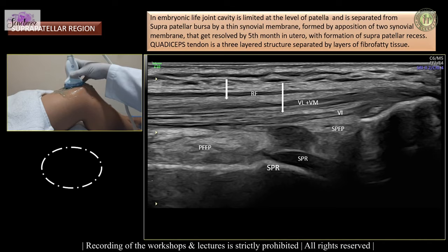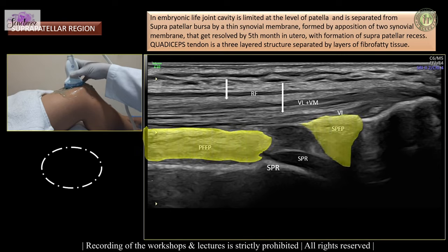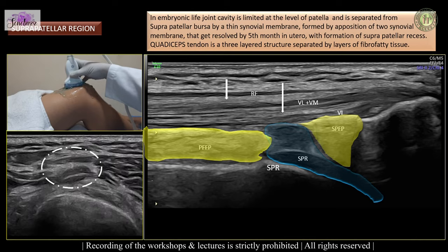Underlying this, we have the suprapatellar fat pad and prefemoral fat pad, which are well-defined and slightly compressible. Between them we have the suprapatellar recess, which is an important area where we check for joint effusion, synovial thickening, or loose bodies. Even in cross-section, we can demonstrate the trilaminar pattern of the quadriceps tendon very nicely.